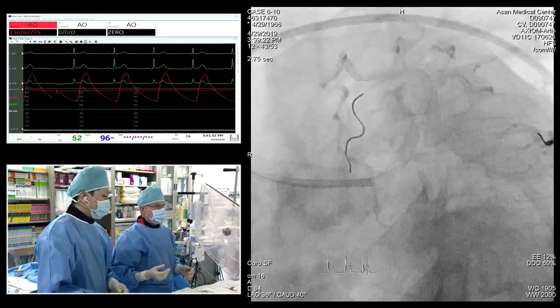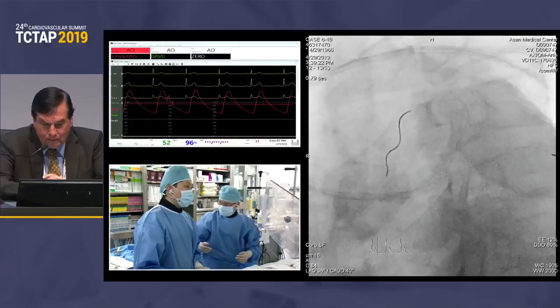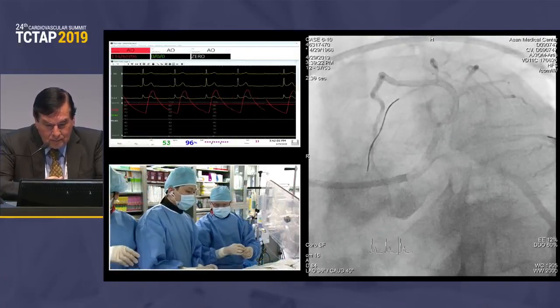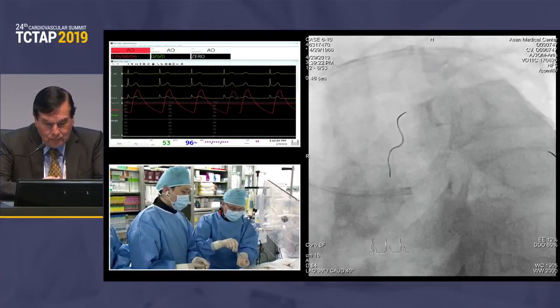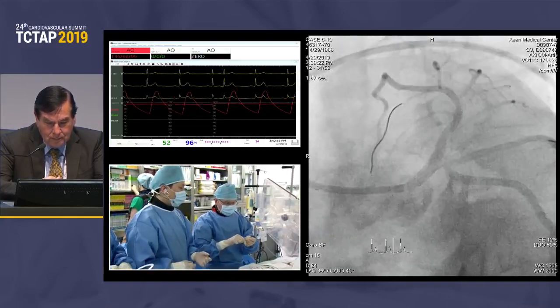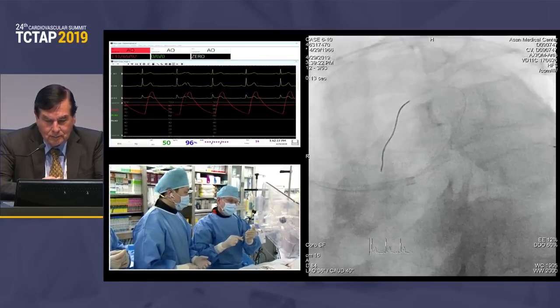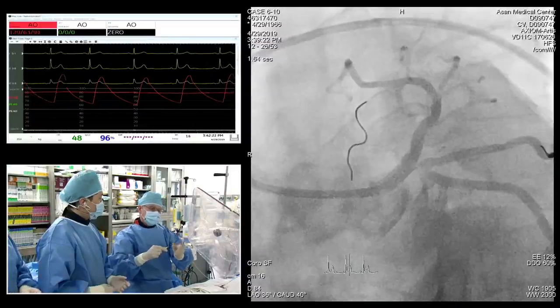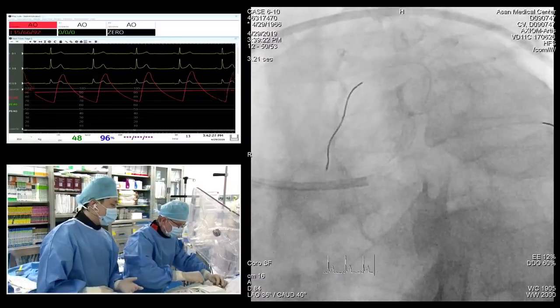Antonio, do you think this is only because of the carina, not shifting plaque? We have been debating for years if it's carina, how much is carina, how much is shaft. I like to think that it's a little bit of both, a little bit of carina shift, but it doesn't look nice. If my surgeon sees this circumflex, they want to take the patient for bypass.